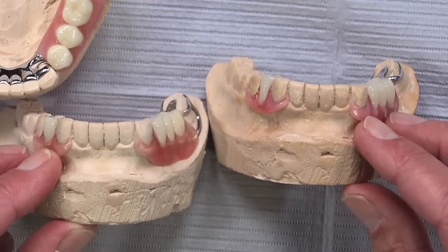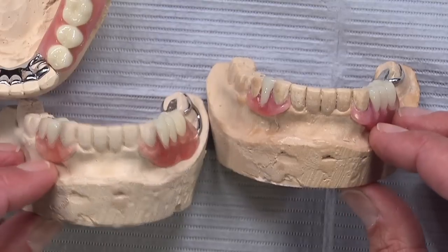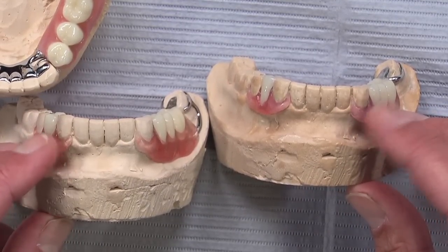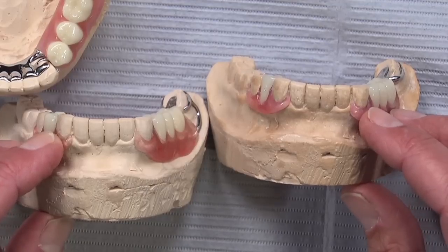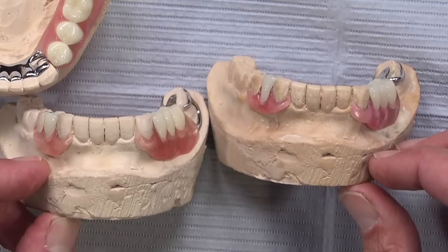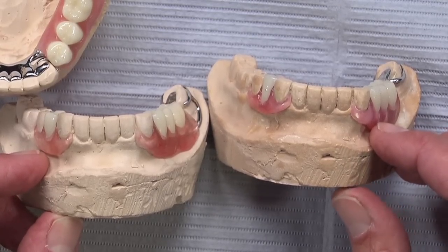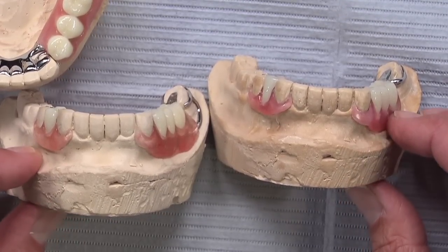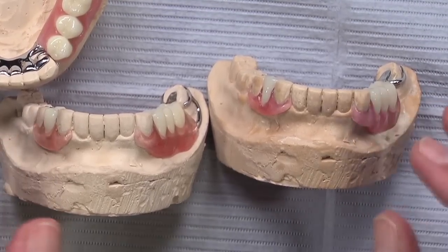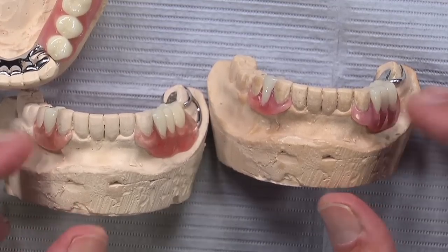But they can only flex so far. There is a limit here, and the ideal undercut is probably about 2 to 3 tenths of a millimeter, about as far as we can go. If it locks in any more than that, it's going to be difficult. And if it does have a severe undercut, the clasp is going to end up covering much of the tooth. So many times we'll make a recommendation to a doctor, or you could do it on your own, to consider some line angle modifications so we can place the clasp properly without having to cover the whole tooth.